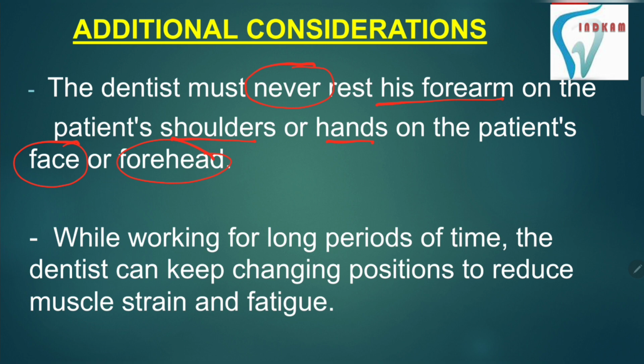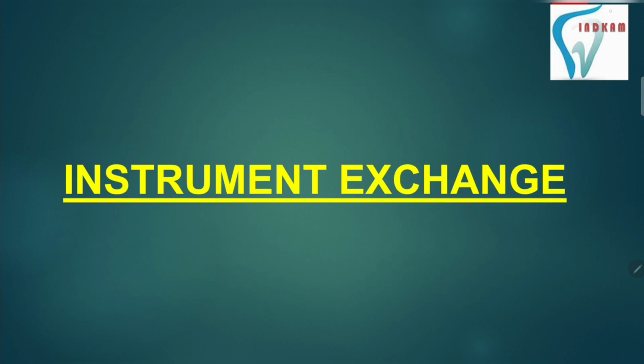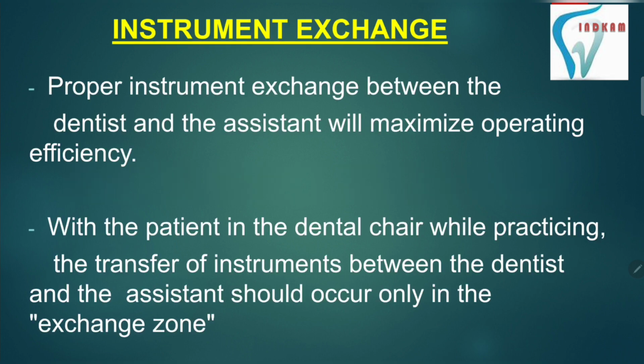While working for long periods of time, the dentist can keep changing the positions to reduce the muscle strain and fatigue. There are certain rules for instrument exchange also, so that the working will be very comfortable and easy for the dentist as well as for the patient.